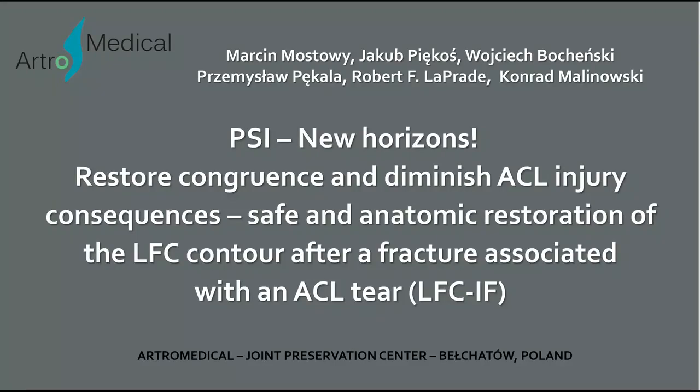This video presents the technique of anatomical restoration of the LFC shape after an impaction fracture associated with ACL rupture with the use of patient-specific implants.